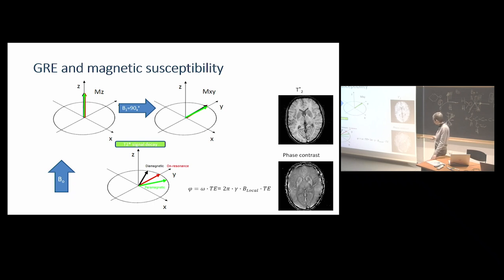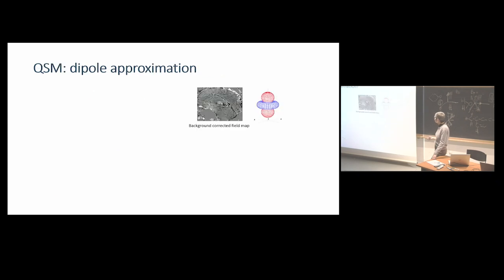And you see there are quite fun effects here where we have a lot of myelinated axons, but also where we have a lot of iron. So the thing is that these effects caused by magnetic susceptibility are non-local. So they are not only in the place where you have iron. You also have these field deviations outside where the iron is.